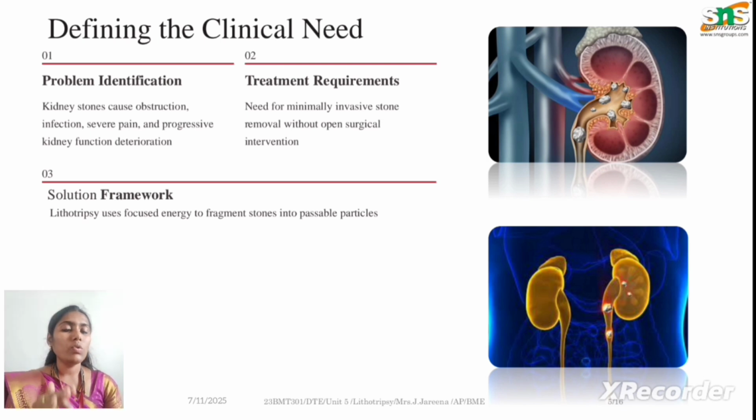The solution we have here is nothing but lithotripsy. Lithotripsy is one sort of technique where we use high focused energy to fragment the stones, to break the stones. This is one sort of non-invasive solution, which is what the patients are expecting. In this way, lithotripsy does exactly the work the patient needs.